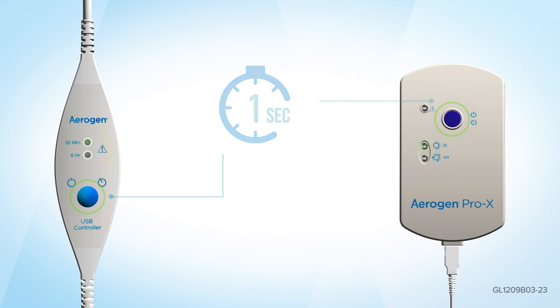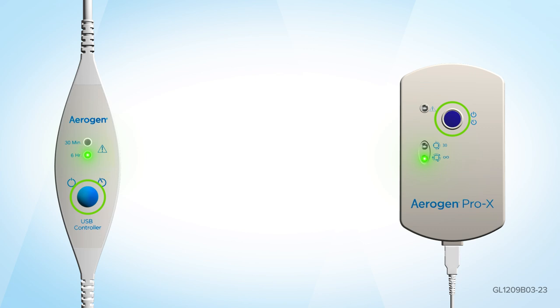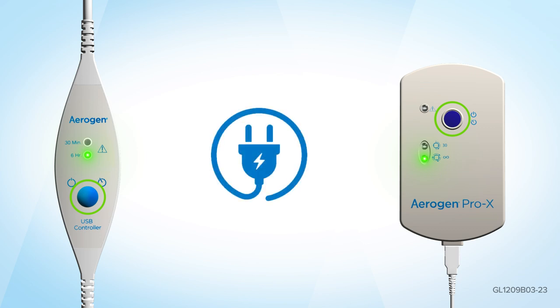When using the Aerogen continuous nebulizer tube set, press and hold the on/off button for three seconds from the off position to operate the Aerogen Prox controller in continuous mode, or the Aerogen USB controller in six hour mode. Please note: to use the Aerogen Prox controller in continuous mode, you will need to be attached to the mains power supply.